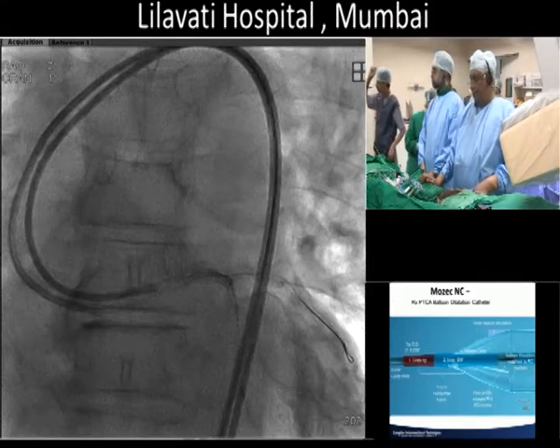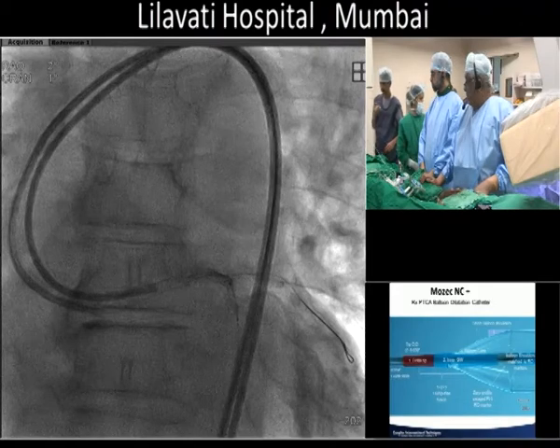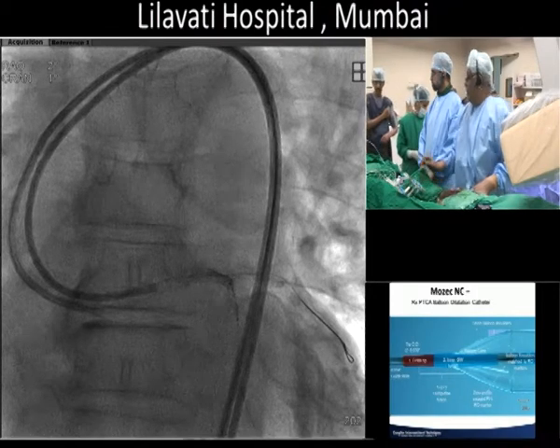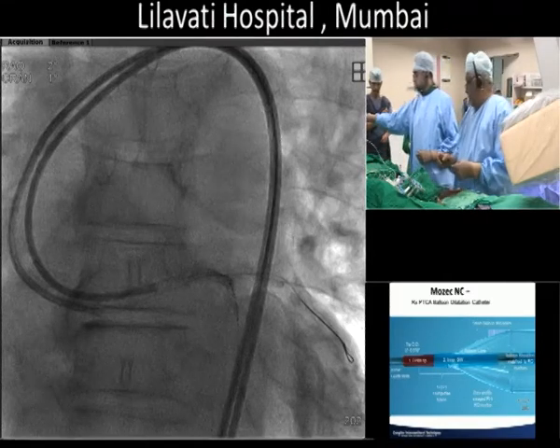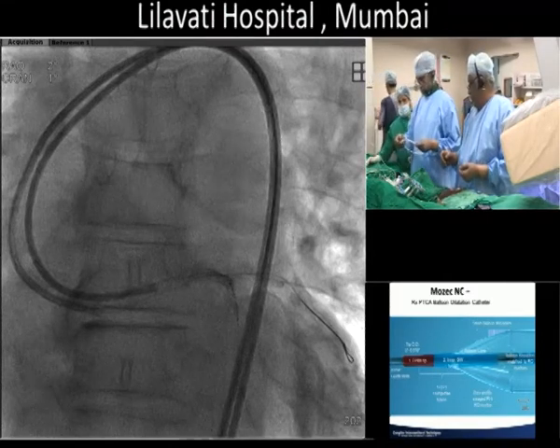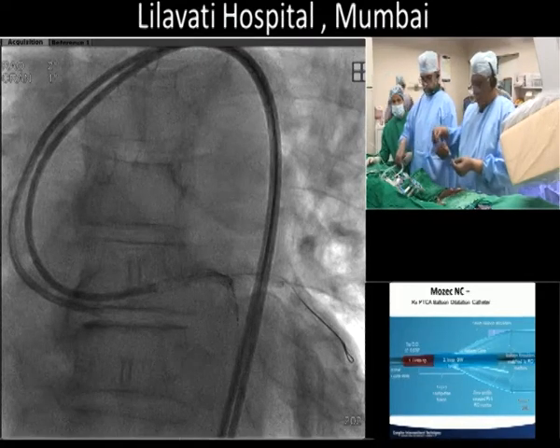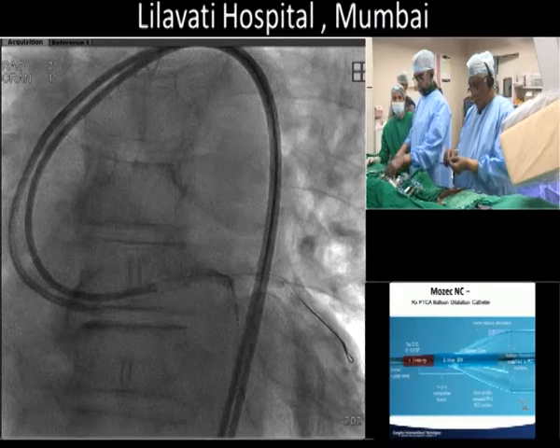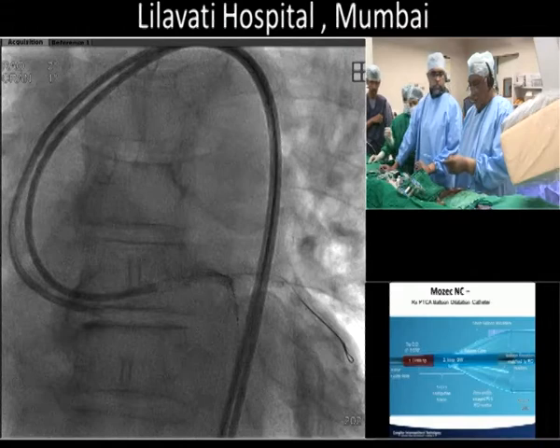The other thing you can do, which I often do, is use an 8 French guide system, although still 3 stents in 8 French is tough. 3 balloons in 8 French is not a problem. But this is another technique, the dual guides. We use dual guides often for CTOs, clearly, even sometimes in the left system when we're doing retrograde.